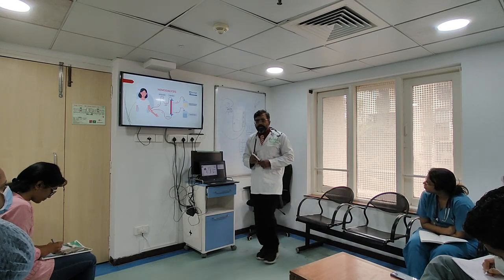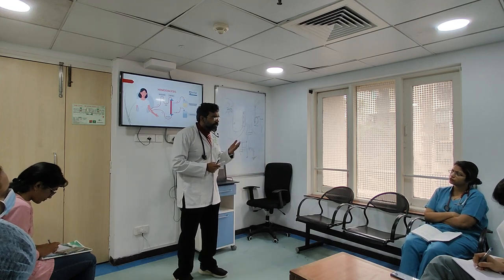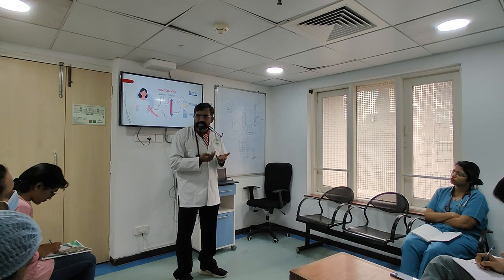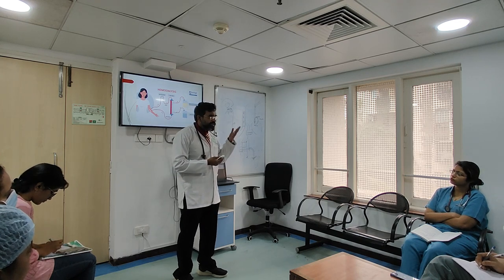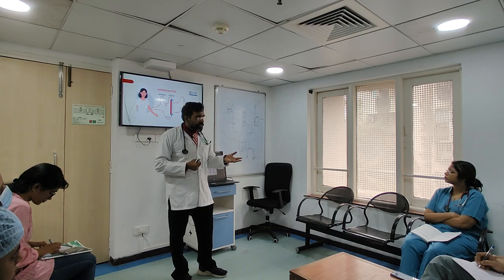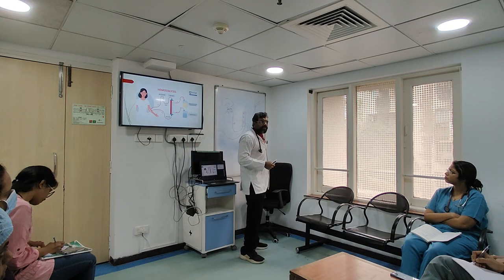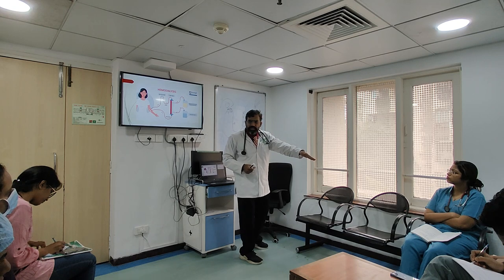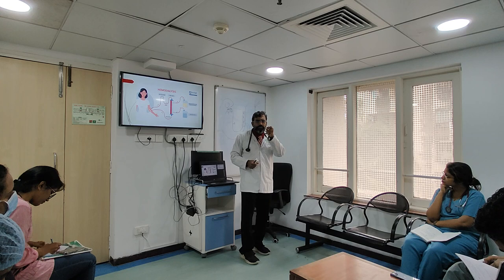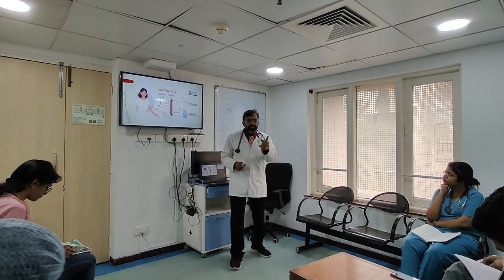So that is why, as I told you in the last lecture also, the access has to be very, very good. If your access is not good and you do all these funny things of changing lumens, the efficiency of the filter, the efficiency of the therapy goes down majorly. Access recirculation occurs. That is why I want to use the blue for the distal, where I am going to return blood back into the body, whereas I want to use the red for access. That means I want to draw the blood from there for my treatment. So it's not a good practice to change that lumen.